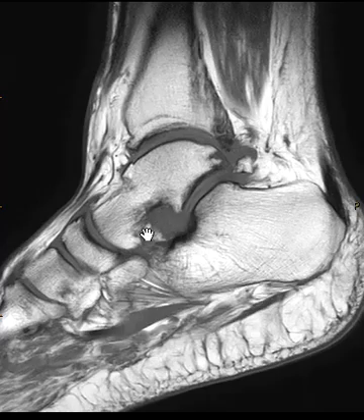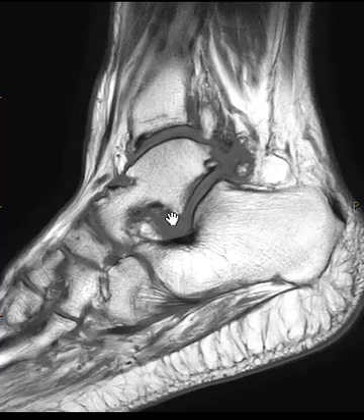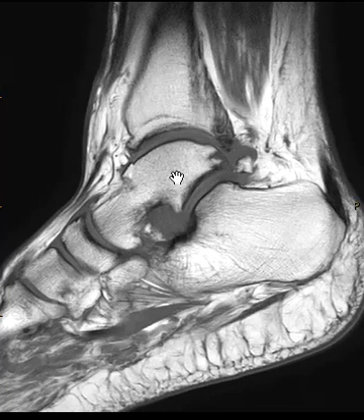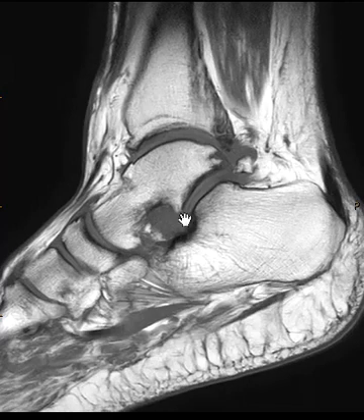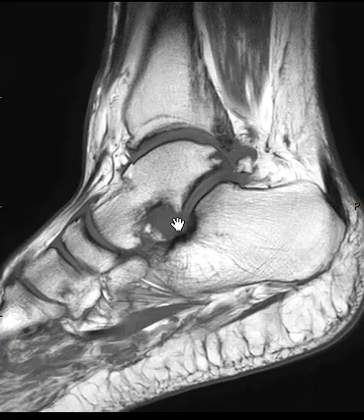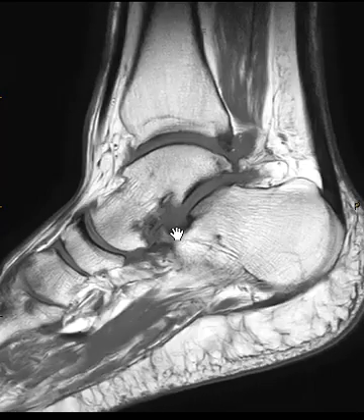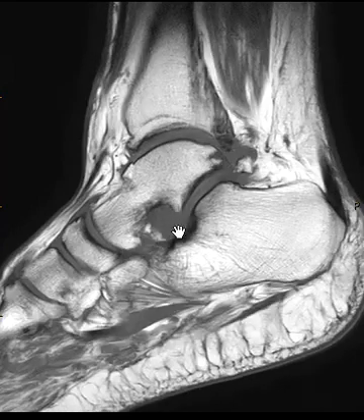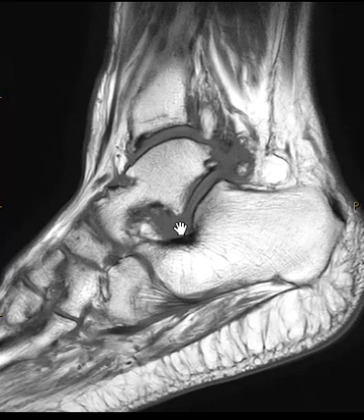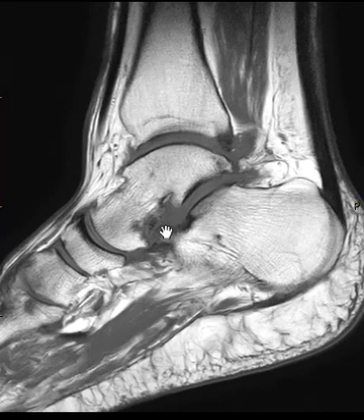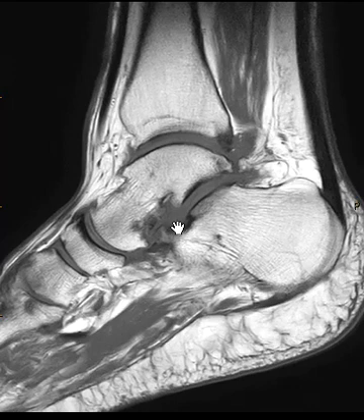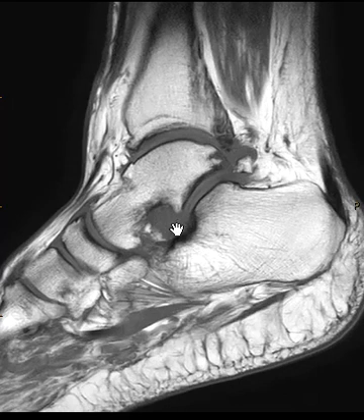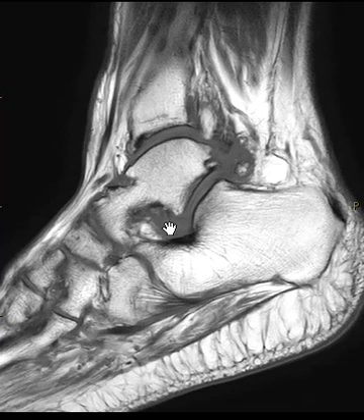This is the sinus tarsi, which is this cupped area below the talus and above the calcaneus. Normally we would see fat in here and some ligaments — we have the cervical ligament going forward and the talocalcaneal interosseous ligament going this direction — but we don't really see those ligaments very well because it's just filled in with this gray tissue. When we see gray tissue we think about a synovial inflammatory process.